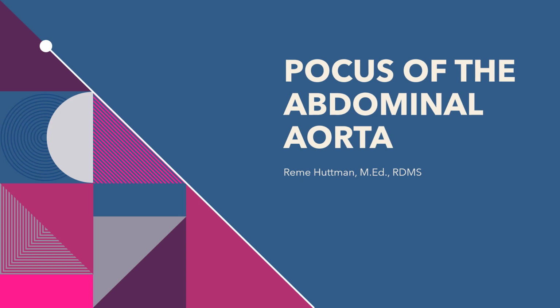Joining us for our point of care ultrasound of the abdominal aorta. A lot of this is going to be review for you physicians and practitioners, but hopefully you'll find some of the information helpful in your everyday scanning.